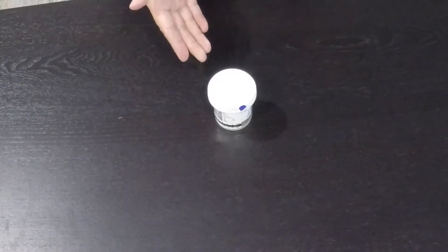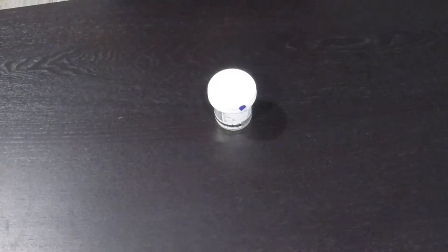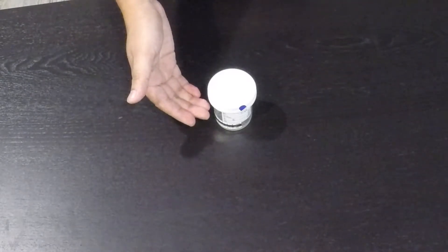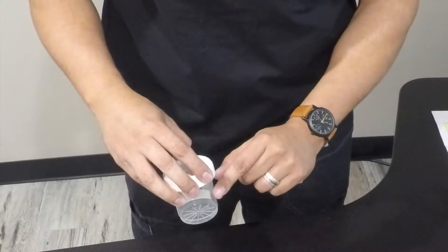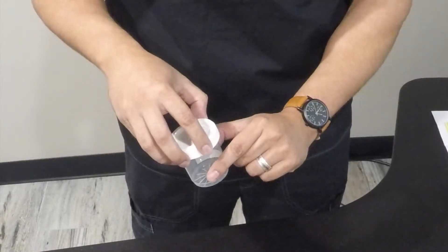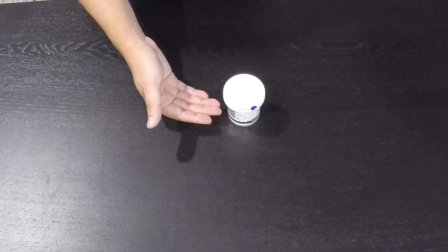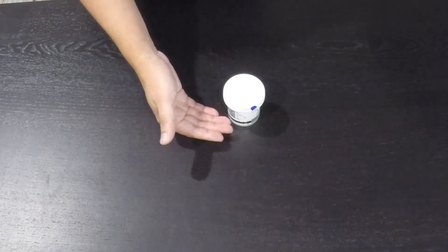The MA will then provide the specimen cup to the patient labeled with the patient's name, date of birth, date of collection, and time. The patient will need to provide at least 50 cc's of urine, or halfway through the cup. The temperature strip below lets the MA know whether the urine is correct body temperature.